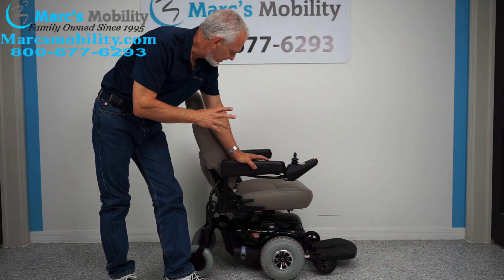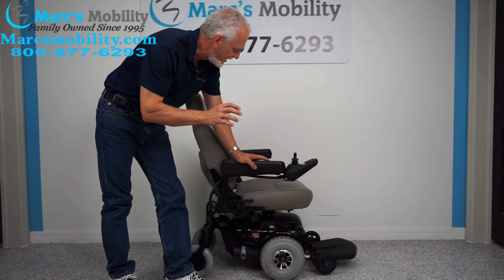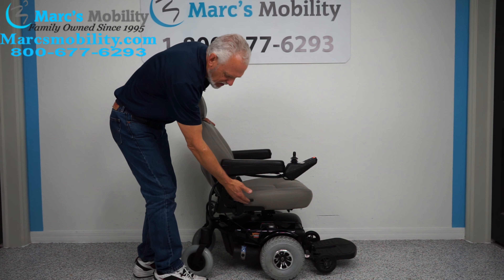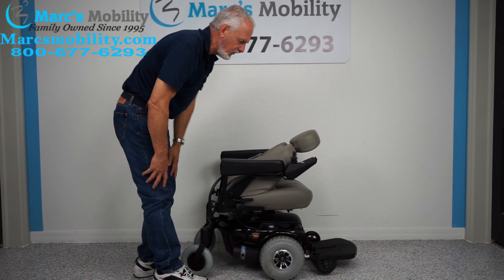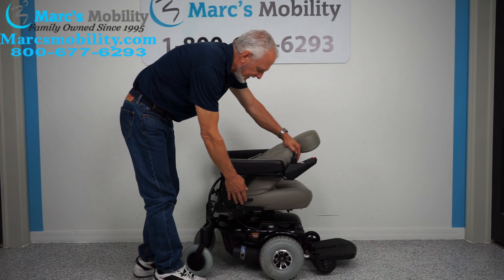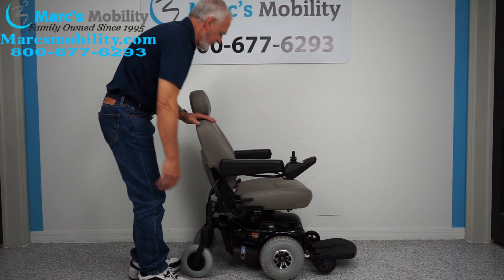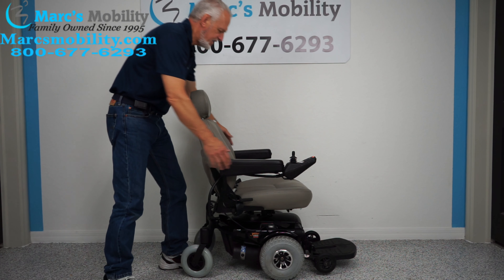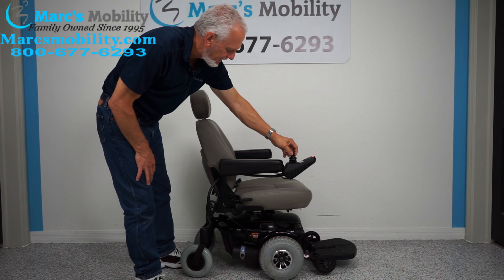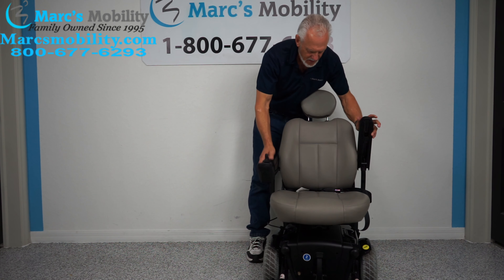To make the seat go up, there's a button on here with a picture of a seat. You push that button and then use your joystick forward to make the seat go up. Here's the seat going up right now — that's the normal noise for the seat. When you're all the way to the top, you'll be roughly at 25 to 26 inches, starting from about 20 to 21 inches and adding five.